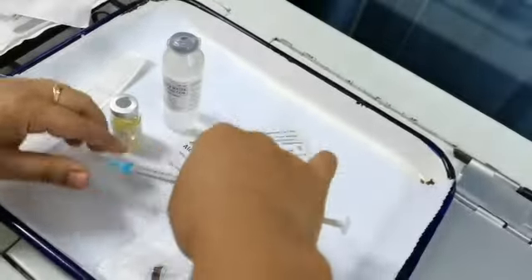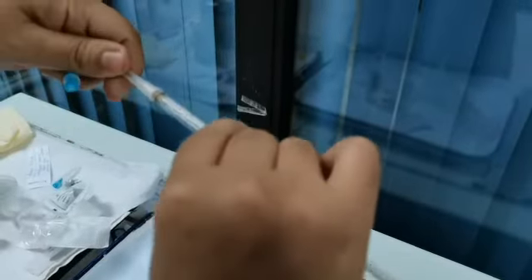Still, check the syringe if there is presence of air. Then adjust the plunger. Then cover the needle using your scooping technique, and now that you have already withdrawn distilled water and medication, you can now change your needle with the gauge 26 needle to get ready with your skin testing.